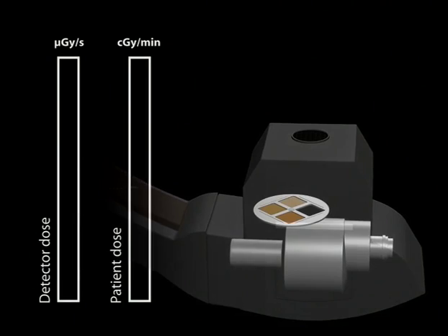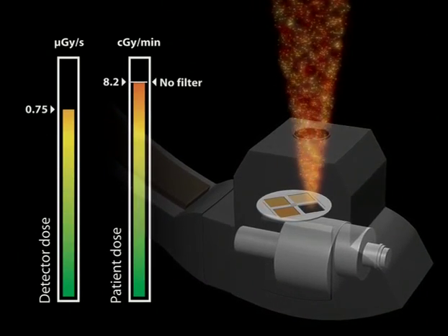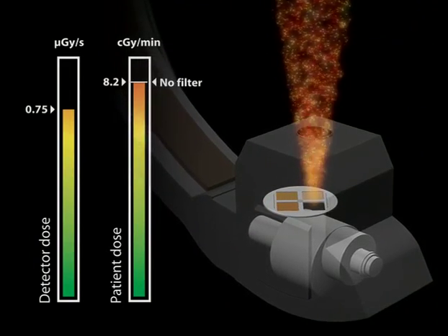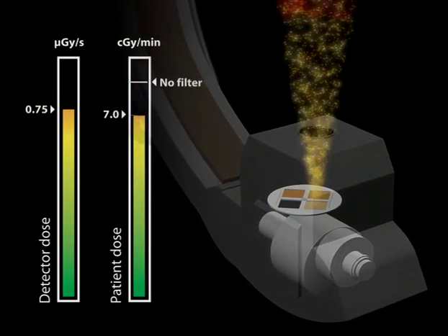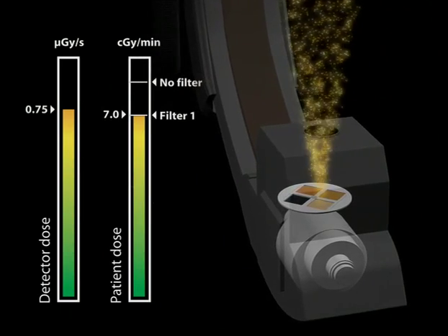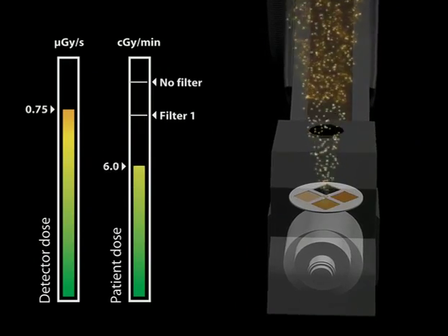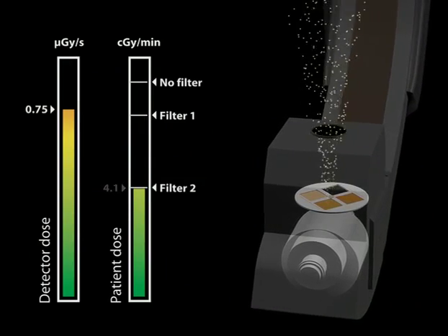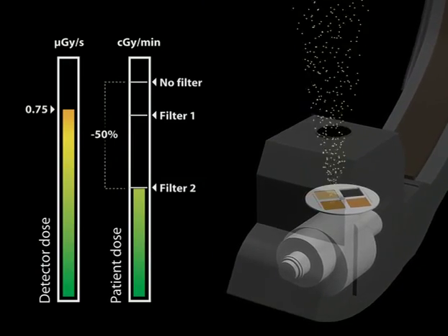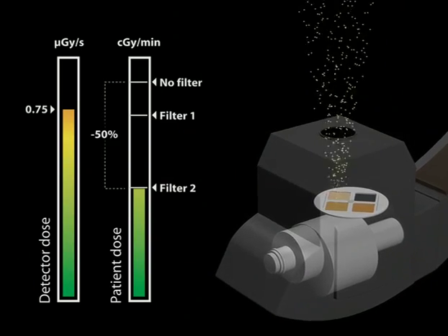Additional filters primarily reduce unwanted soft X-rays that do not contribute to the image quality. Modern systems come with a range of powerful additional filters that can be programmed and operated automatically. Using these additional filters can dramatically reduce both the patient dose and the dose rate for the examiner by up to 80%. This dose-reducing technique is highly recommended, especially in pediatrics and electrophysiology.